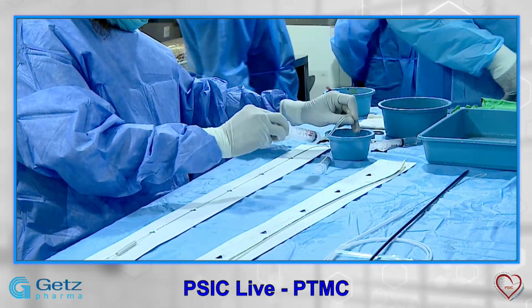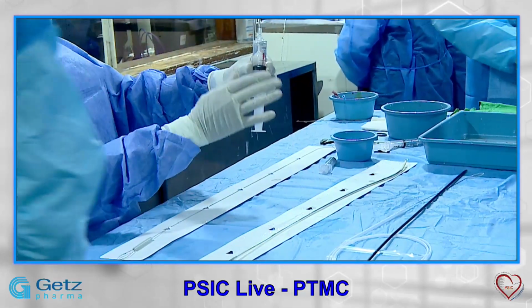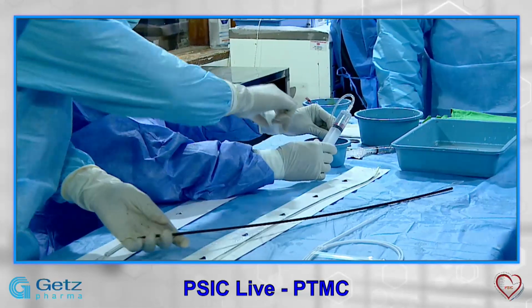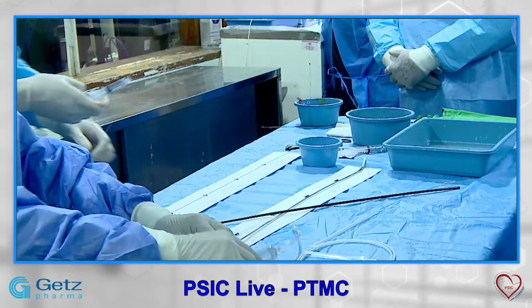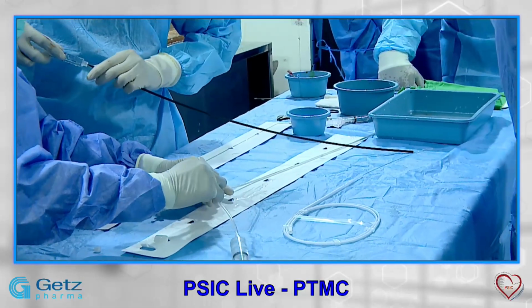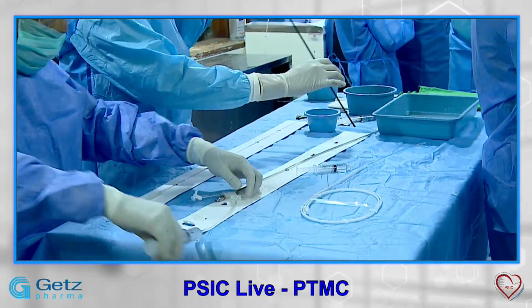Next, we will be discussing a few slides about the septal puncture, so that before we go for the procedure, we will have some idea about what things we are going to do, because we may not be able to stop during the procedure and explain the steps. So we will be looking at some of the slides. Please start my slides.